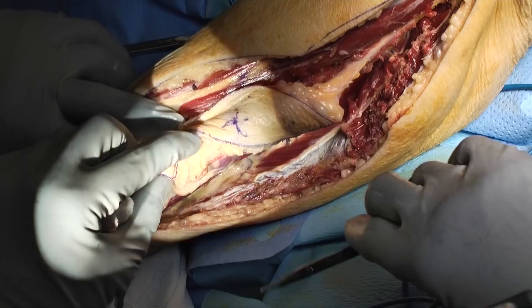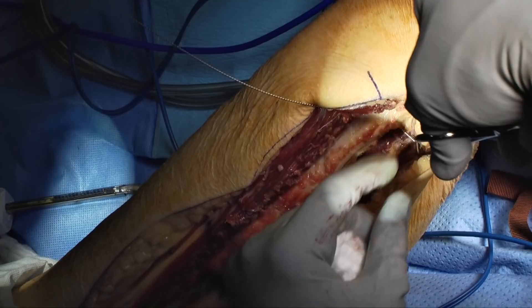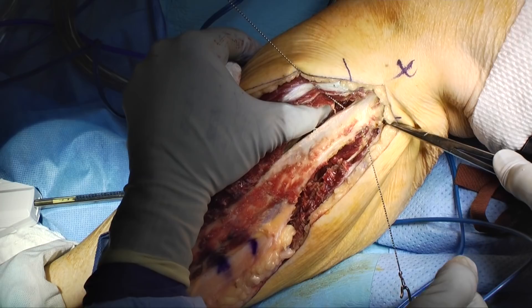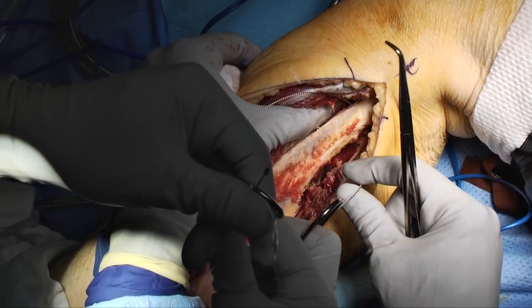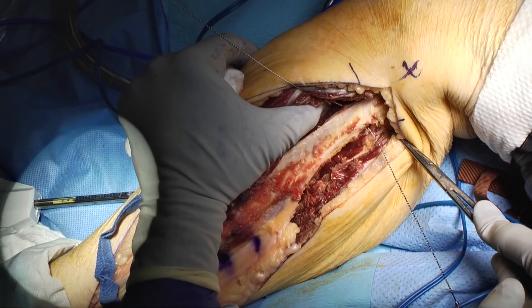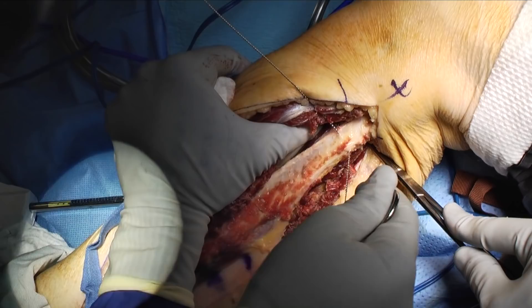The proximal bone cut is then made by passing a curved clamp immediately deep to the fibula just superperiosteally at the level where the bone cut will be performed, then passing a Gigli saw. Cutting from medial to lateral prevents inadvertent injury to the peroneal vessels, which are deep to the fibula at this point. The proper way to use the Gigli saw is to keep the saw handles very wide and cut from side to side rather than up and down — this will keep the saw from locking. Be sure to protect the surrounding soft tissue so it's not abraded by the Gigli saw.